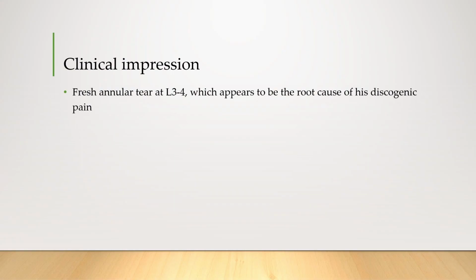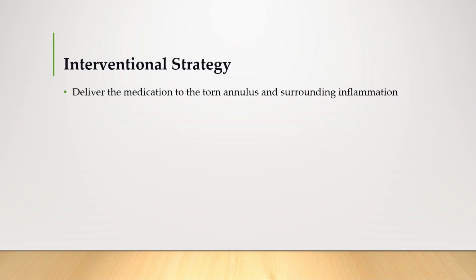Clinical impression. We are drawn to the fresh annular tear at L3-4, which appears to be the root cause of his discogenic pain. This diagnosis guides our strategy for intervention.